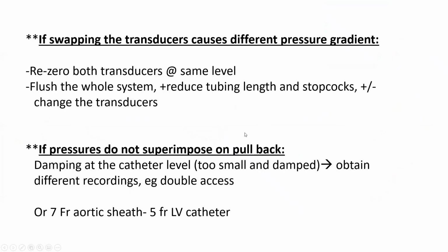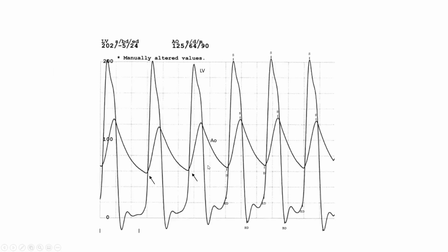So did everybody understand the errors in recording and how to recognize them first and how to correct for them? Okay. So it's very important to recognize those in our era. Did everybody understand that? I'll show some examples of cases I've had where such errors were made.